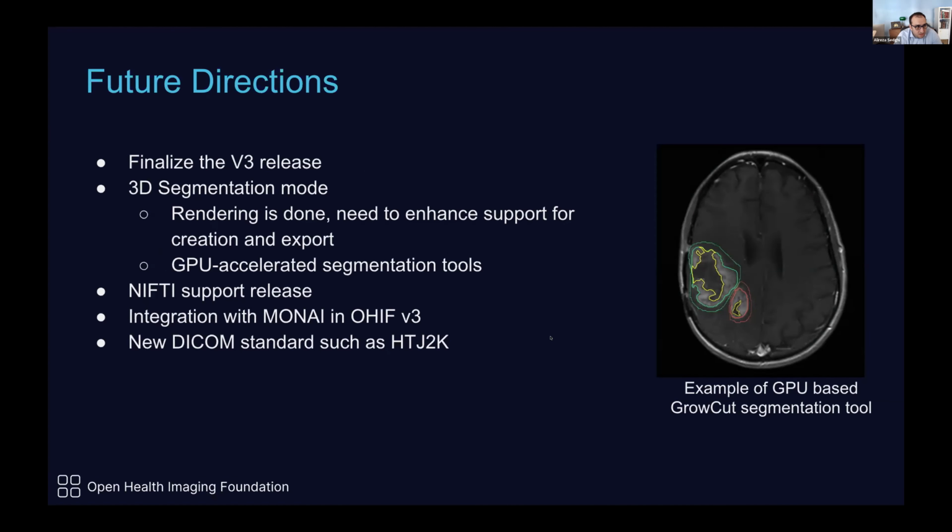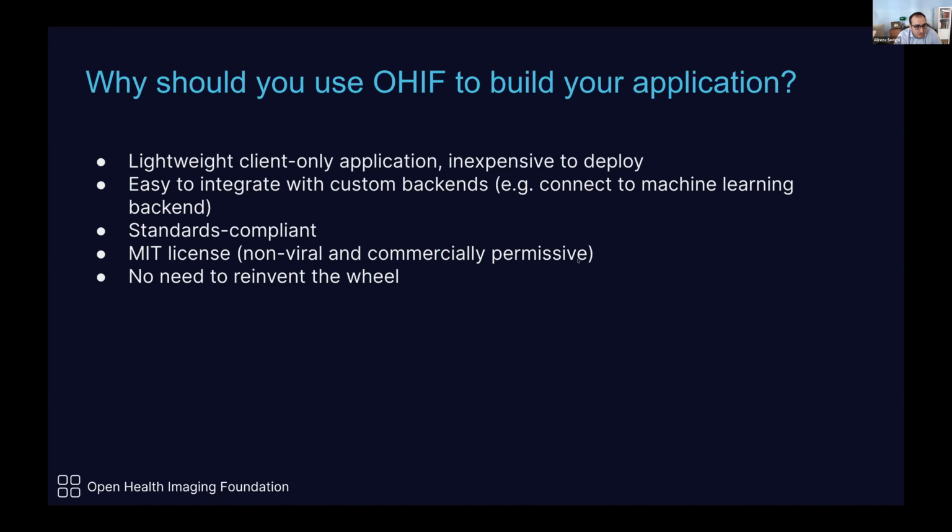So finally, why you should choose OHIF to build your application. It's lightweight, client only. There is no server to run the application, inexpensive to deploy, easy to integrate. It's standard compliant, MIT license, and basically you don't need to reinvent the wheel.